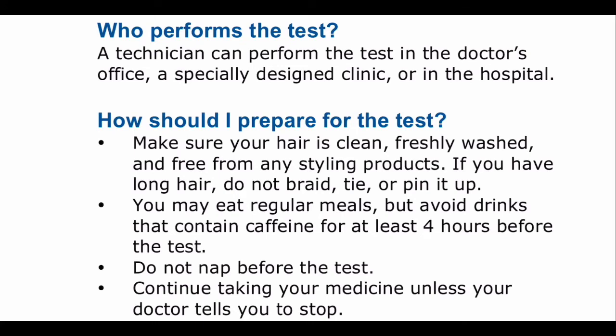Who performs the test? A technician can perform the test in a doctor's office, a specially designed clinic, or in the hospital. For example, every single EEG that I've done on a patient has been in the hospital. How should I prepare for the test? Well, make sure your hair is clean, freshly washed, and free of any styling products. If you have long hair, do not braid, tie, or pin it up, because we're going to have to make marks on your head to mark exactly where the electrodes go.